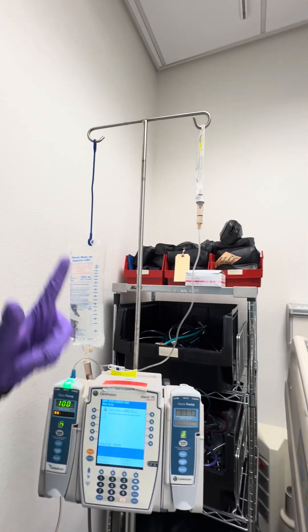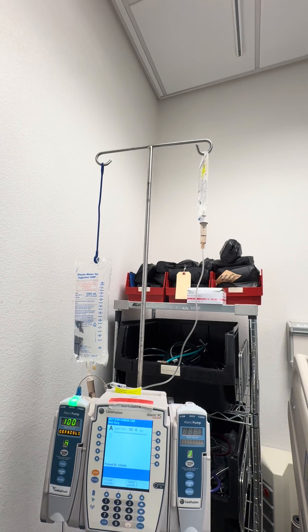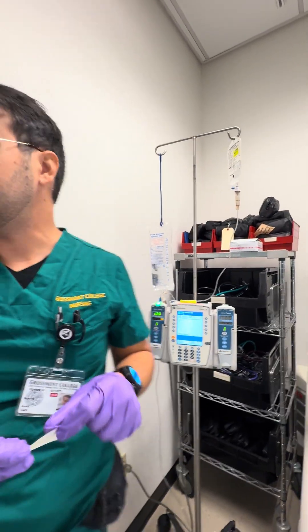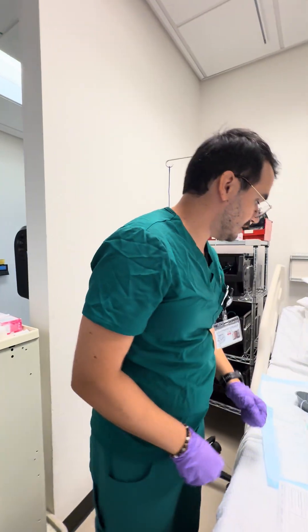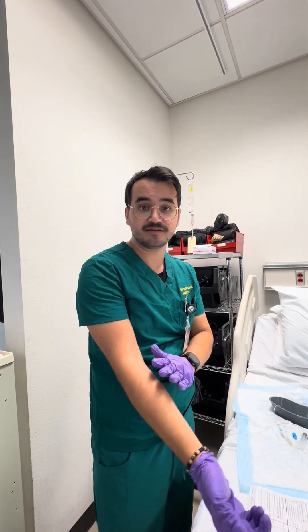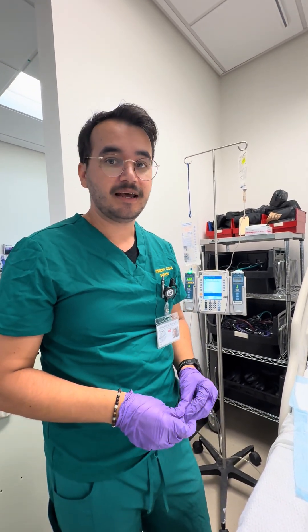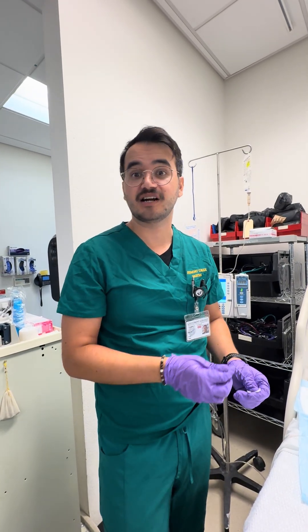Before leaving, we verify the medication is flowing through the line properly. We label the secondary line — for medications, labels are good for 12 to 24 hours depending on hospital policy. We inform the patient to let us know if they have any questions or concerns, if they feel any burning at the IV site, develop any rash, or experience symptoms of anaphylaxis such as throat tightening. We stay with the patient for 10 to 15 minutes to monitor for any immediate adverse reactions.